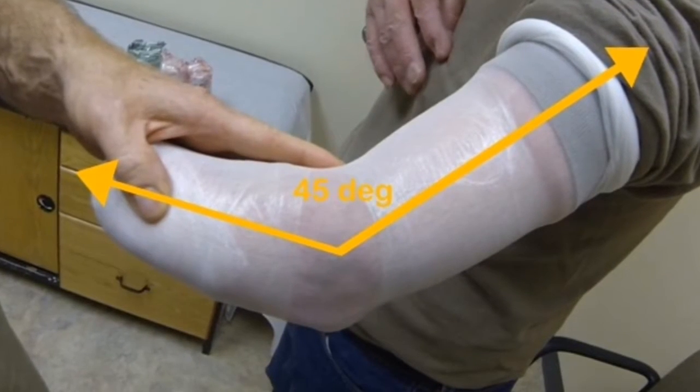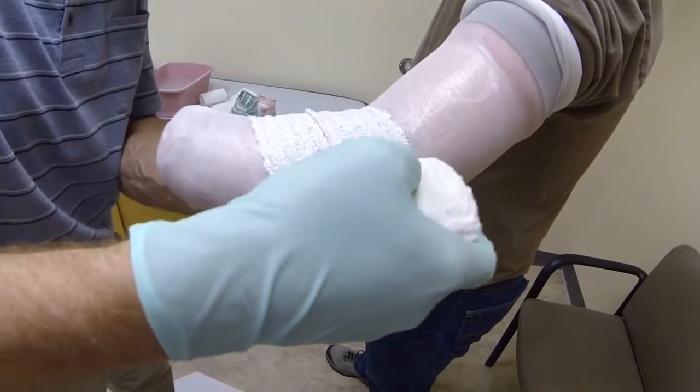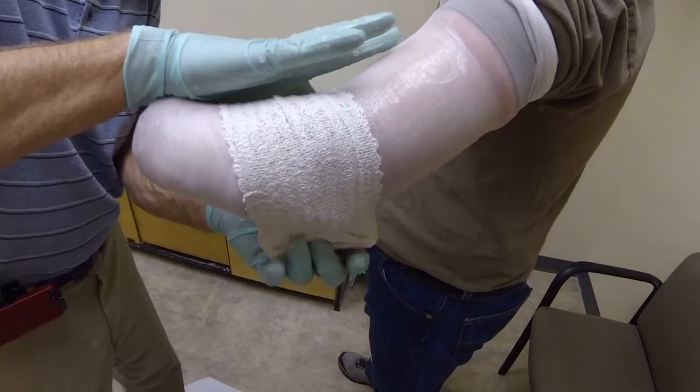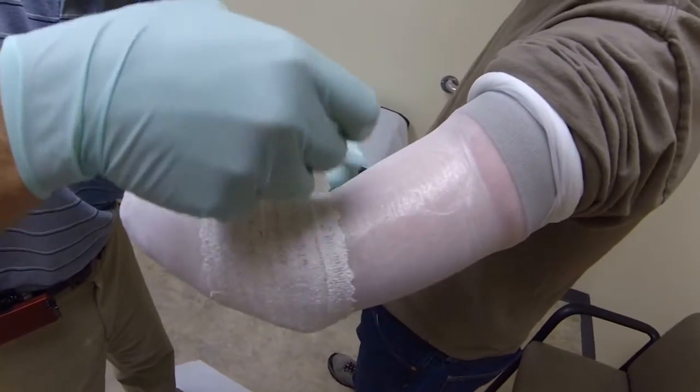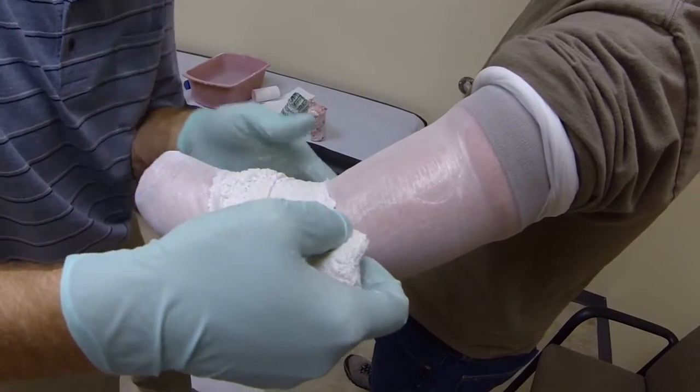Maintain the elbow at 45 degrees of flexion during the casting procedure. Wrap the limb with elastic plaster as shown. Be careful to apply the plaster to create a smooth cast — there should be no roping that would create deep spots in the cast.